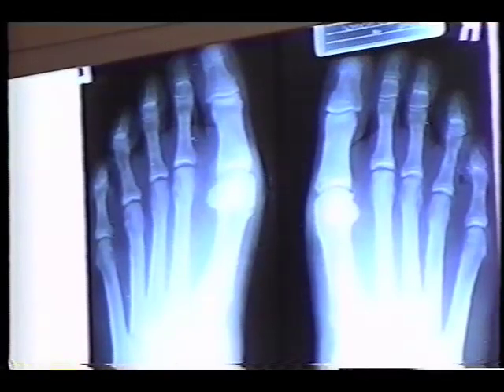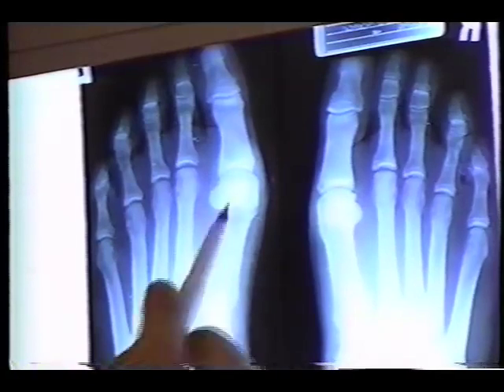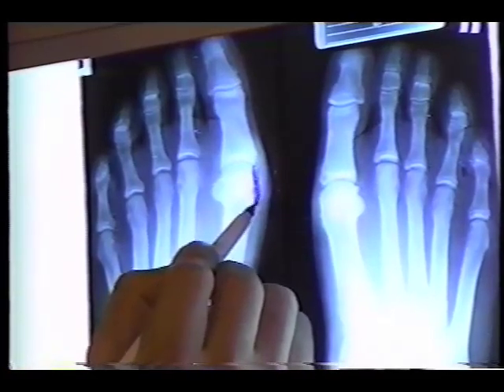And it's that crooked joint which causes malalignment, maltracking of that joint, that keeps banging those bones into each other, and the arthritic bump forms. We know we've got a crooked joint, and we know we've got an arthritic bump. Here's the arthritic bump right up in here, and this is all arthritic bone. And so we are going to clean that off. But that's not enough. Let me show you what we're going to do.